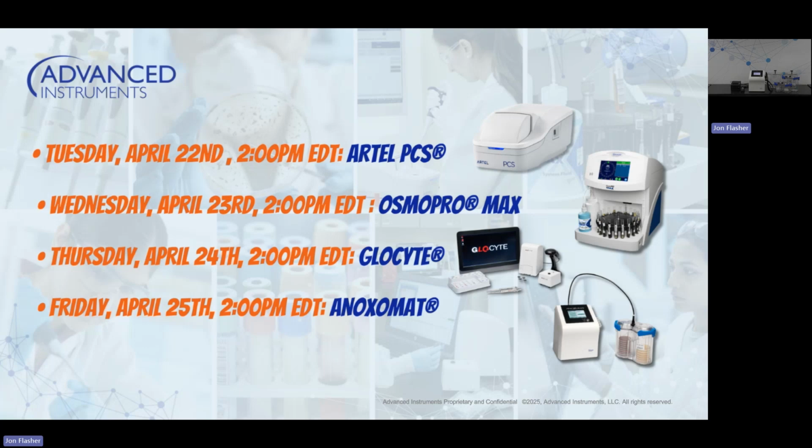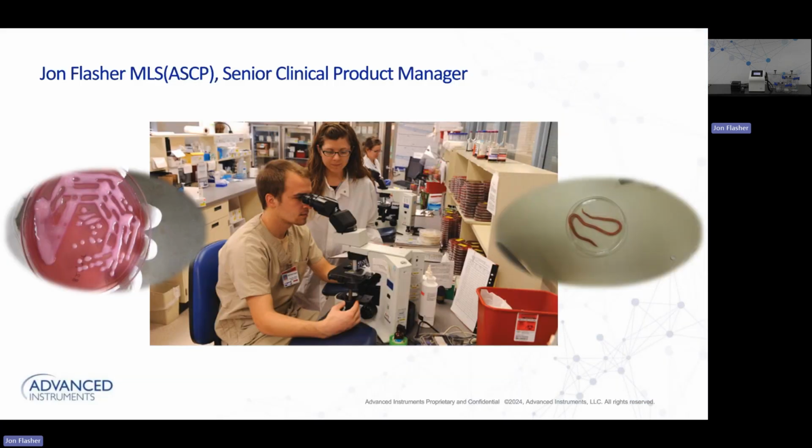Today, we're going to talk about the Anoxomat III anaerobic jar system. So who am I to talk to you about the Anoxomat anaerobic jar system?